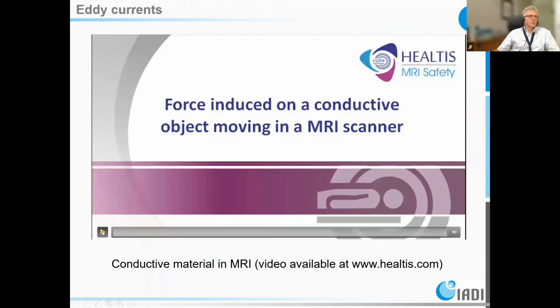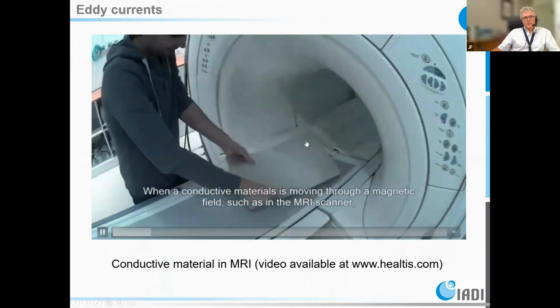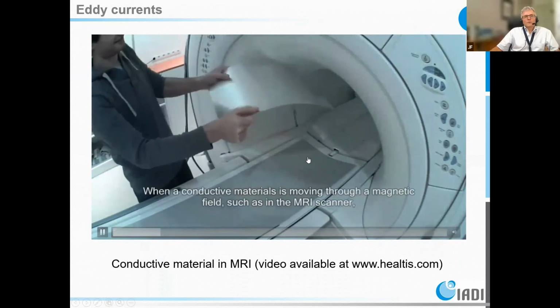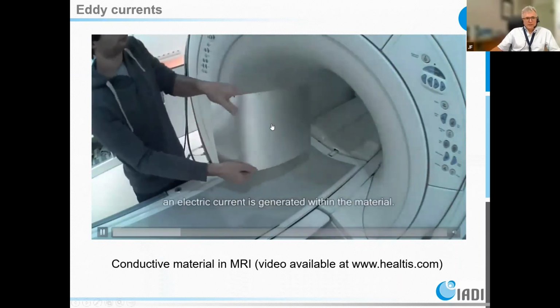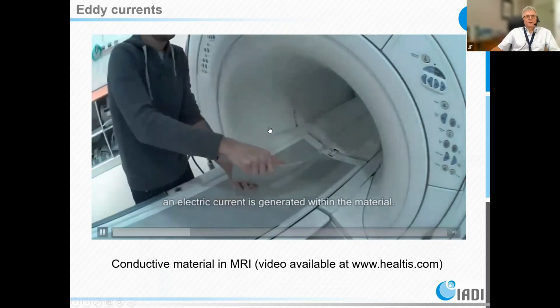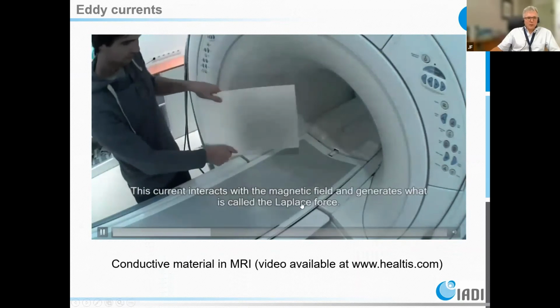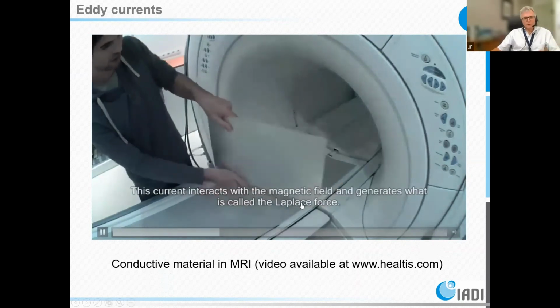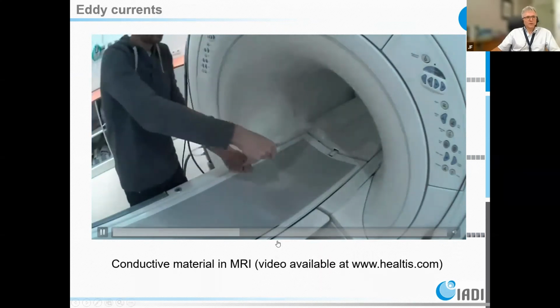This is some information about the eddy currents. Just to understand that if you have something moving, or if you change the current in some conductive material, this is here a conductive plate. You see it's very difficult to move it close to the system. This is due to the Laplace force. I will give some information next course too. So the guy is doing some sport here. He's trying to move it.